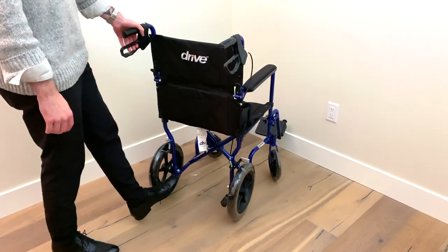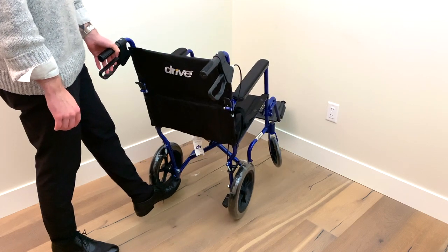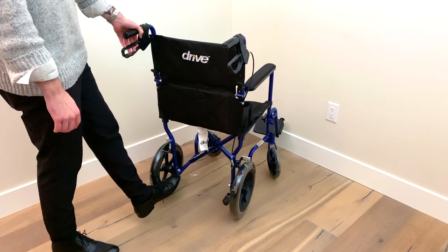If you need to get this chair over a small bump, you can press your foot on the designated knobs to help lift the front of the chair.